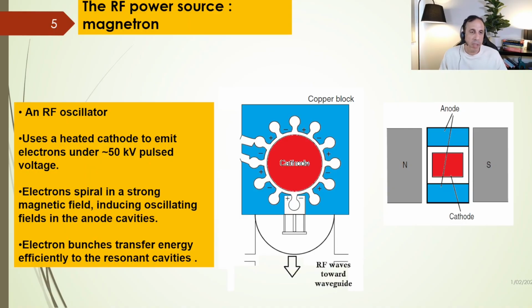And the other thing is that when we have the electron source, the electron gun, and the electrons are sent inside the waveguide, at the same time we should have the radio frequency wave inside our accelerating waveguide. So we need a source of radio frequency waves at the same time. By injecting the radio frequency wave and electrons simultaneously inside the waveguide, we can accelerate the electrons.